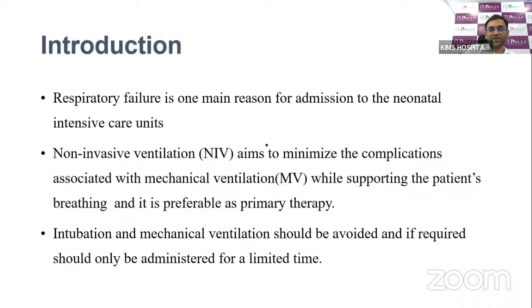Respiratory failure is one of the major causes for NICU admissions, and the majority of centers use non-invasive ventilation as a predominant mode of ventilation in order to prevent further damage from mechanical ventilation. But sometimes intubation and mechanical ventilation is unavoidable, and then we need to shorten the duration of the mechanical ventilation.